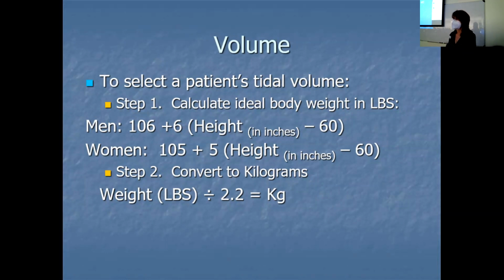Tiffany, you have a question? Well, if somebody's height is below 5 feet, wouldn't that number be off? Yeah, below 5 feet, this won't work. Oh, so people 5 feet and higher. I'm curious what they do for that. Yeah, so you would be 105 only. Okay, so if you don't reach it, they just go with 105 and nothing less. Yeah.